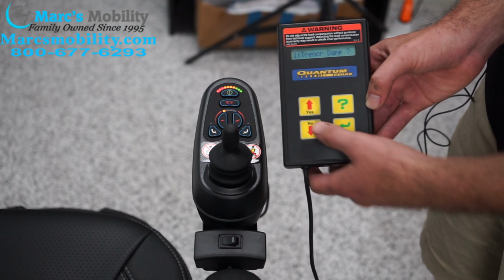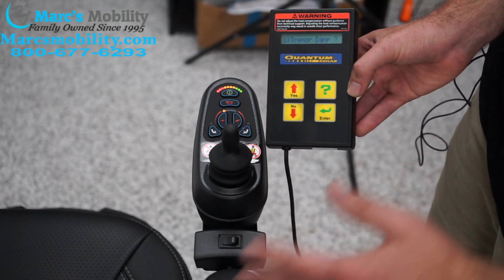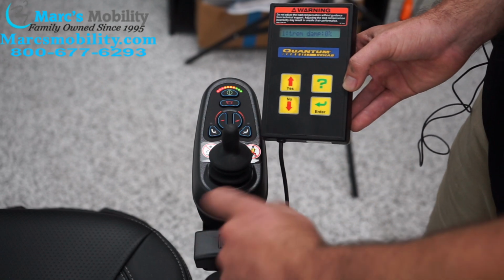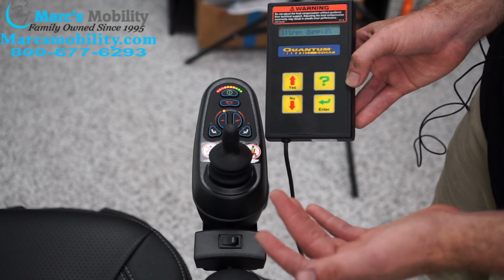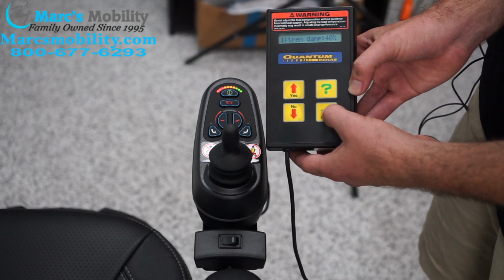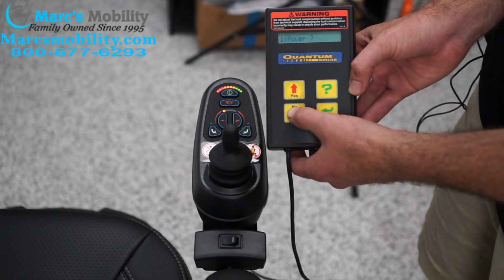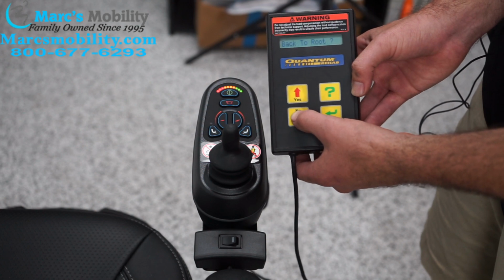Tremor damping is when you push forward, let's say you have tremors in your hands, you don't want the joystick to react and go all different directions. So you can edit tremor damping. So if you're shaking, the chair will not deviate from the main path that it's going on. It's set to 0. You could set it to 40. But I'm going to go back down just because this is a factory chair. I don't want to actually set that. Power is not really relevant to you programming your chair, same with preset.